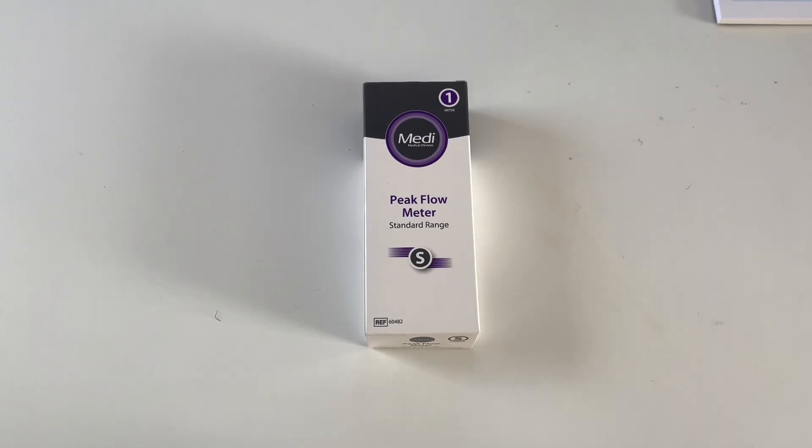Dari, hello. It's the middle of June 2022 and you are looking at the MEDI peak flow meter standard range.